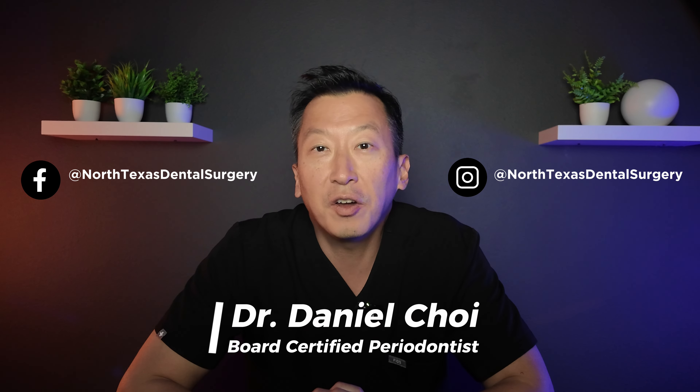Imagine getting dental implants and thinking the hard part is over, only to discover the type of gum tissue around them could make or break their long-term success. Today I'll walk you through a real case where we uncover implants and dive into a crucial detail often overlooked — the difference between keratinized gingiva and oral mucosa. I'll show you what to look out for inside a patient's actual mouth so you can understand why the right kind of gum tissue is essential for the durability and comfort of dental implants.